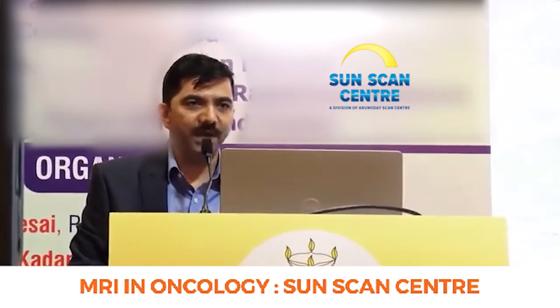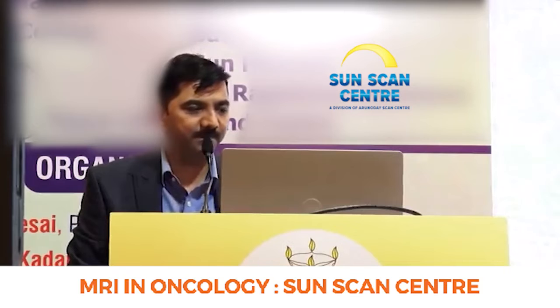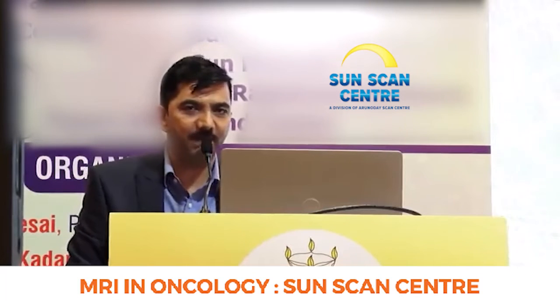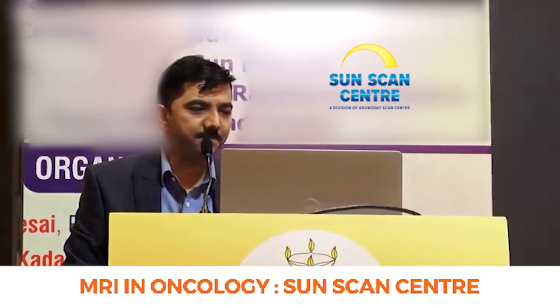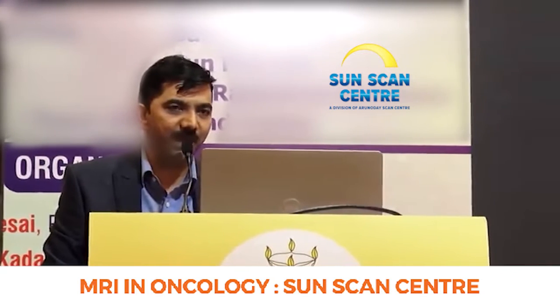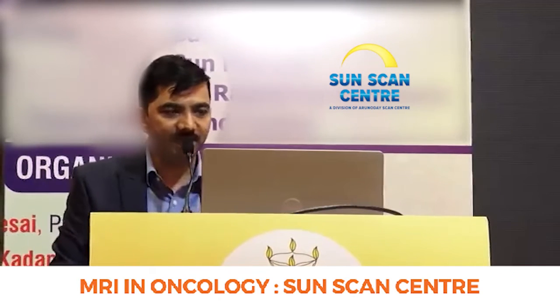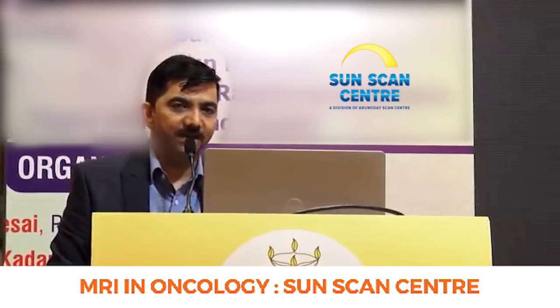But now we have further developments in contrast MRI as well. And definitely as technology moves ahead, we have higher applications which enable better imaging. Going on straight to the clinical applications. Now this patient has a gross abnormality in the left high frontal region on the FLAIR axial. And whenever we see this kind of edema, a contrast is definitely required to be given.